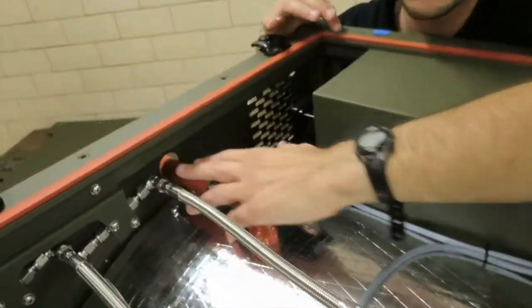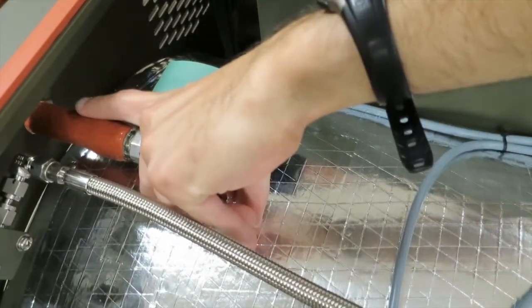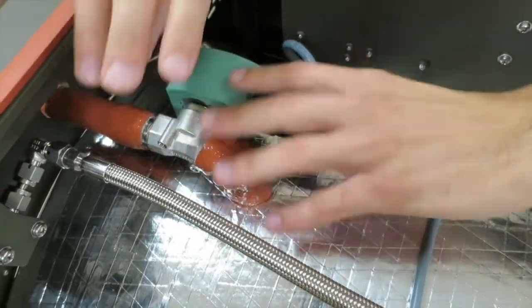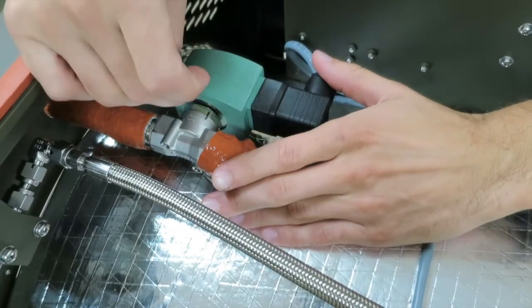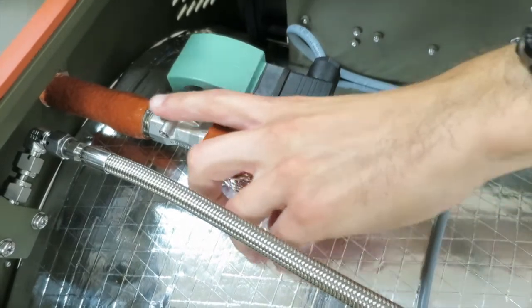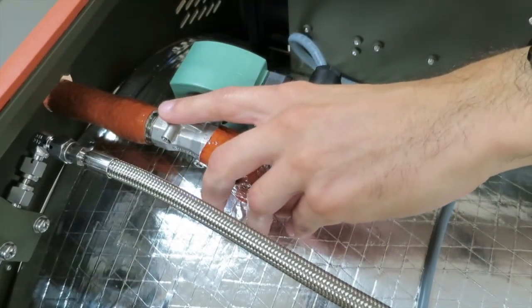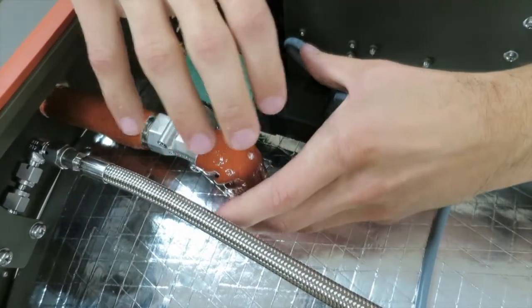Alright, so here's the sterilized valve that I was talking about. And the flow arrow is towards the back of the sterilizer. And again, I was talking about the sizzling. If you hear that sizzling, this is the valve that is malfunctioning. So if it was stuck open ever so slightly, steam is going to come out of the jacket, start to condense in this tube, and then drip into the chamber and sizzle. So this is a very critical valve. It's attached to the jacket and the chamber.